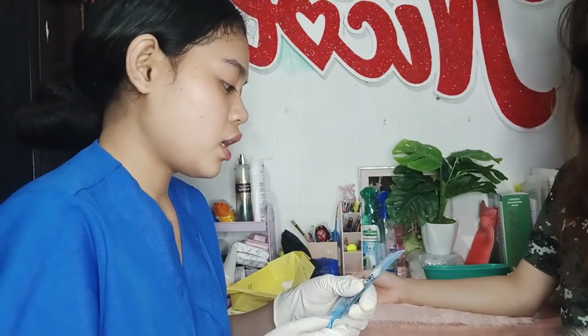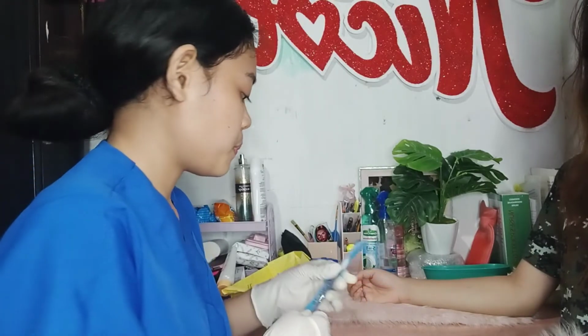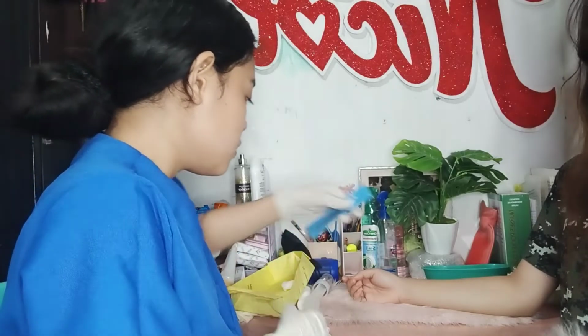Make sure that the specimen tube contains the data of the patient. That includes the time, the date, and also the name, the birth date of the patient, and also the age of the patient. Also the specimen type that I get, which is the blood.